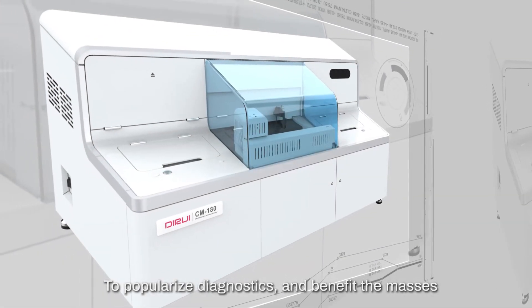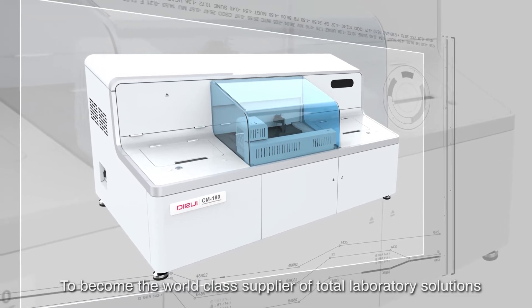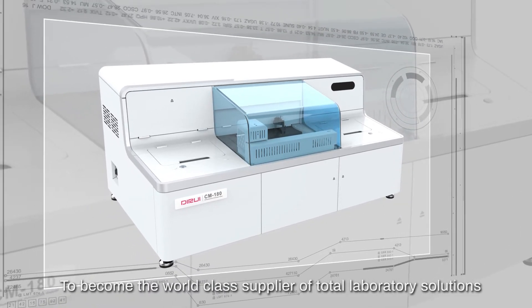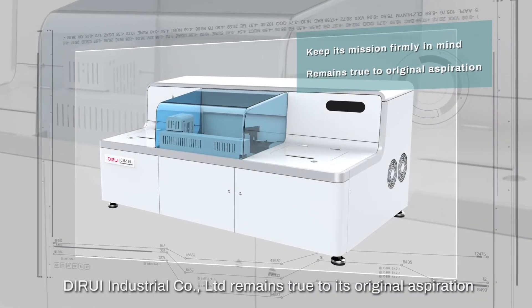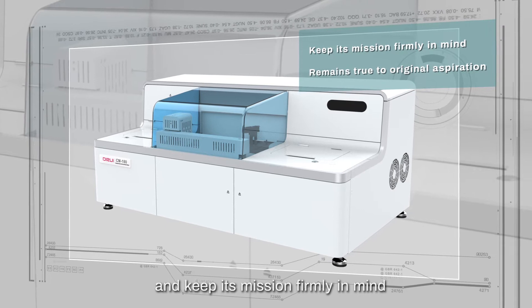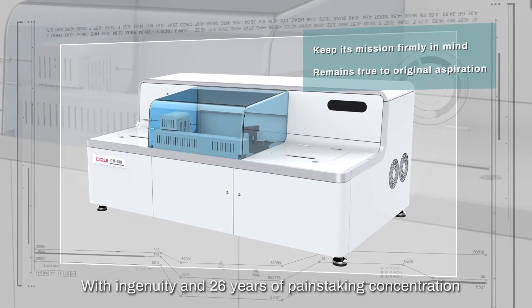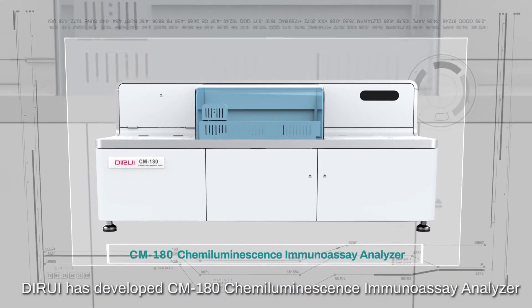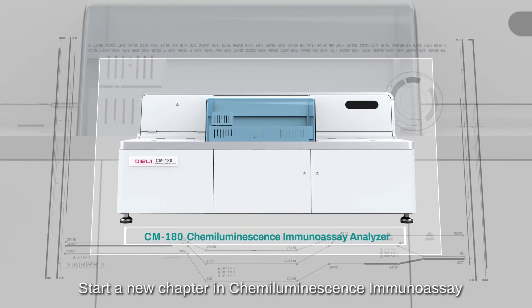To popularize diagnostics and benefit the masses, to become the world-class supplier of total laboratory solutions, Dirui Industrial Company Limited remains true to its original aspiration and keeps its mission firmly in mind. With ingenuity and 26 years of painstaking concentration, Dirui has developed the CM180 Chemiluminescence Immunoassay Analyzer, starting a new chapter in chemiluminescence immunoassay.